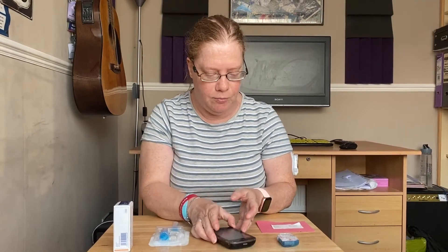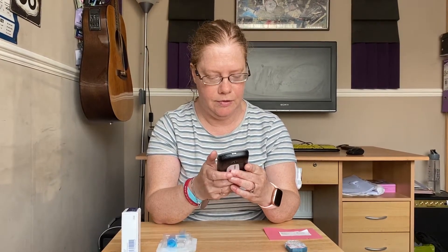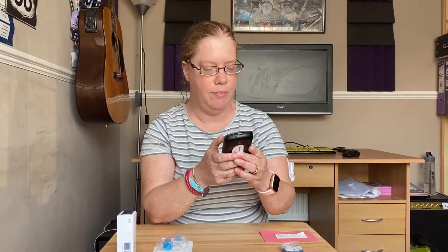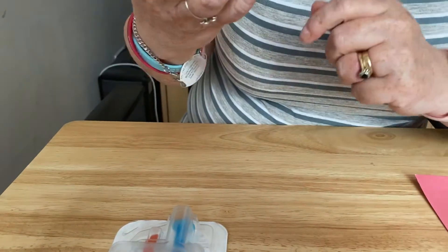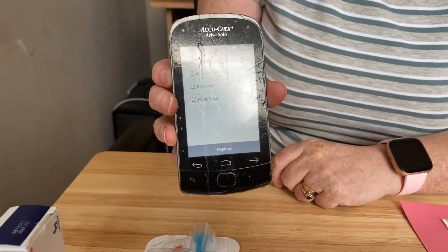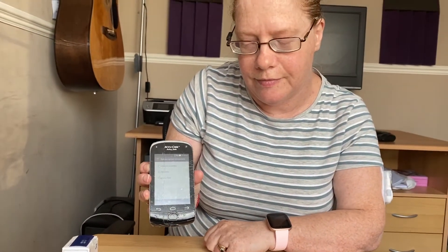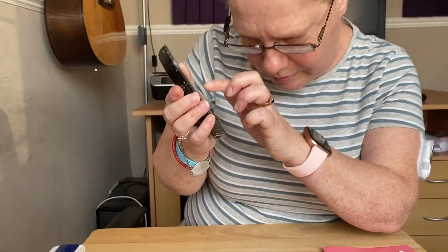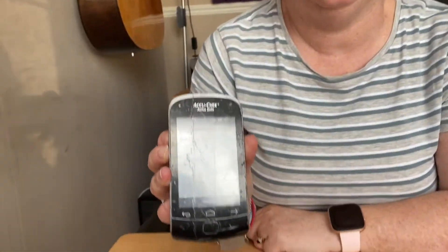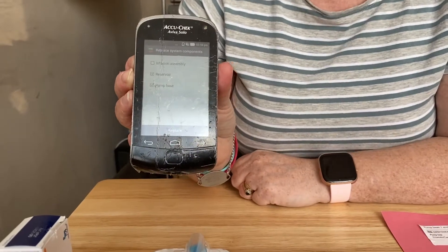First, I'm going to turn my handset on and go to the main menu and press release. On release, I have options for infusion assembly, reservoir, and pump base. I'll press pump base, and I get two ticks — it says reservoir and pump base — and I'm going to change both of those.